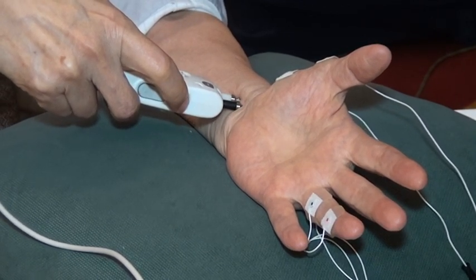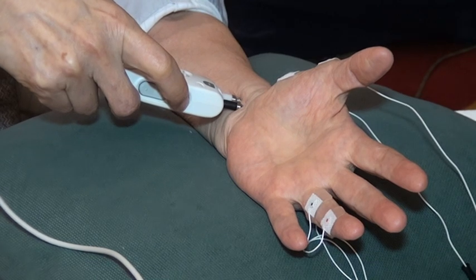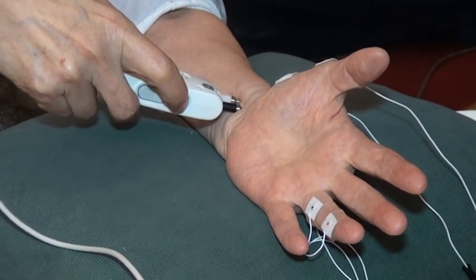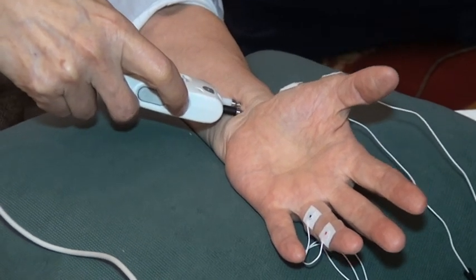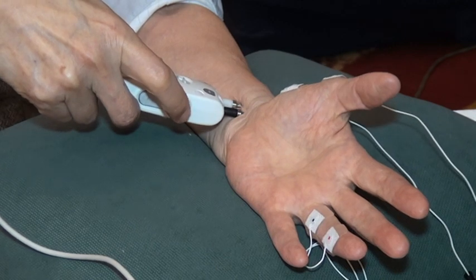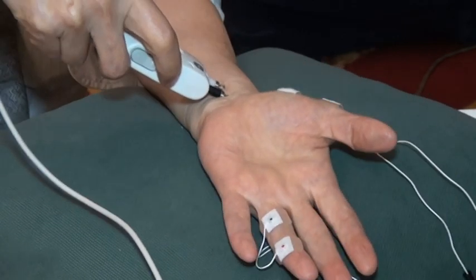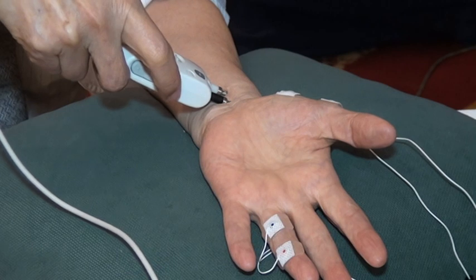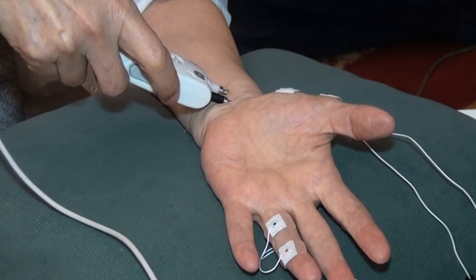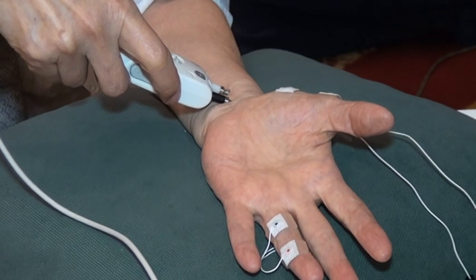First thing to do is what? Muscle twitch. Yes, very good. So did you do that? You are all looking at the waveform, but the muscle twitch is over the right side. What kind of twitch is that? Do you feel the muscle twitch? What is that movement? Abduction. So it's okay.